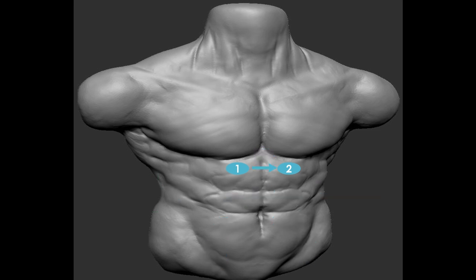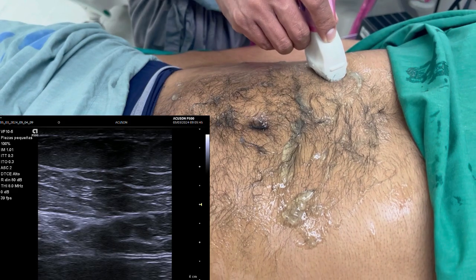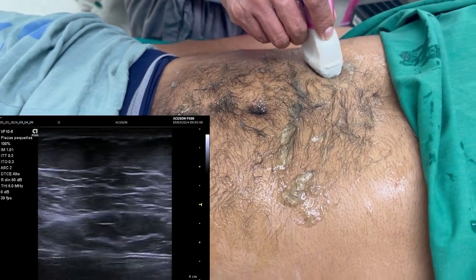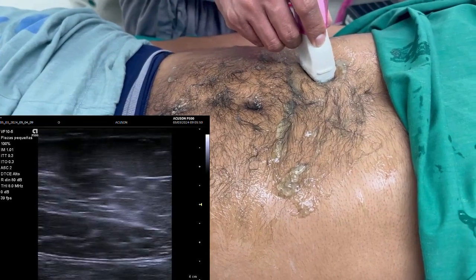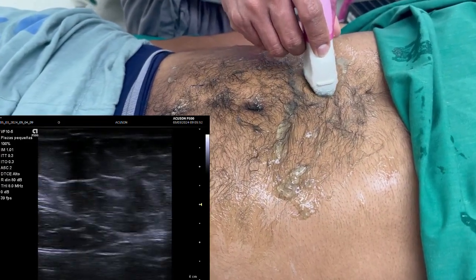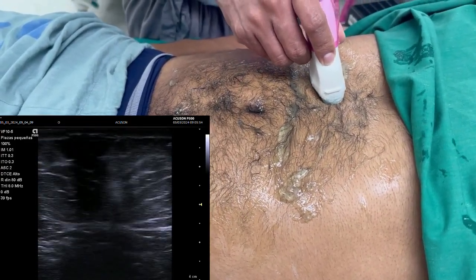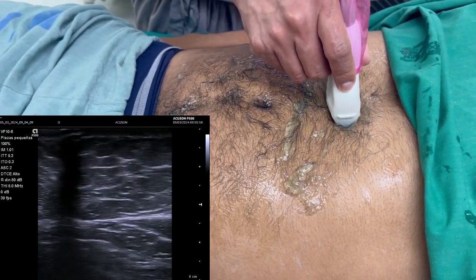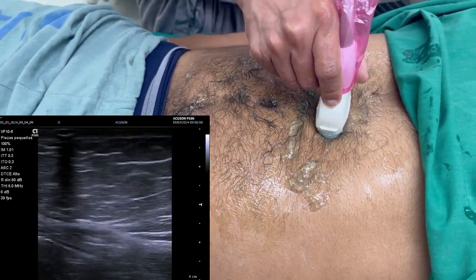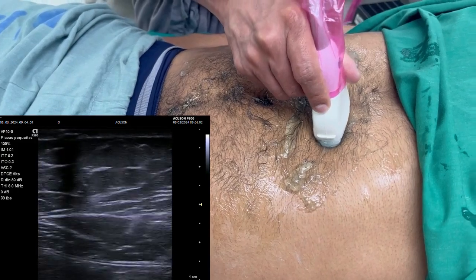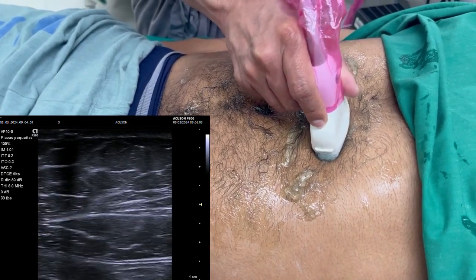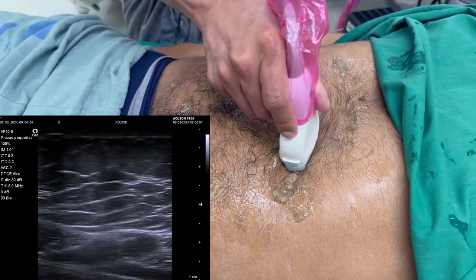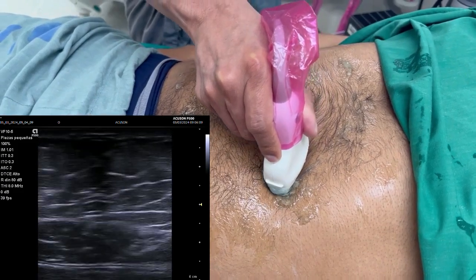In steps 1 and 2, we evaluate the upper abdomen at the subcostal area, scan the right rectus abdominal muscle in its entirety, and measure if possible the width of the right rectus abdominal muscle. We then cross the midline and advance towards the left rectus abdominal muscle, which we measure in the same manner.